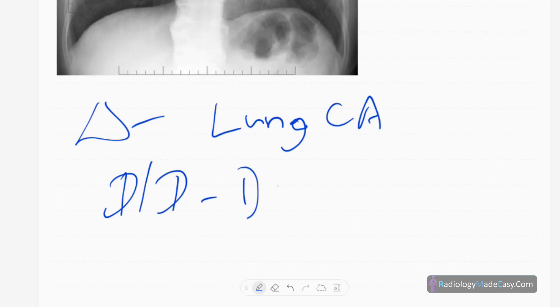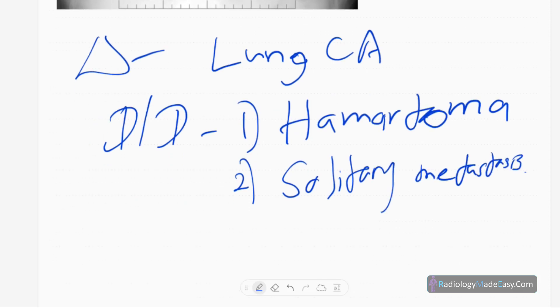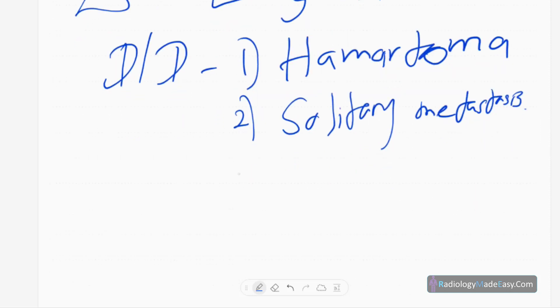In a hamartoma, there are popcorn calcifications. Another differential is a solitary metastasis. In children, you can also get round pneumonia as a cause of a solitary pulmonary nodule.